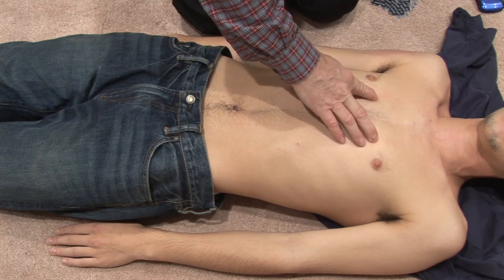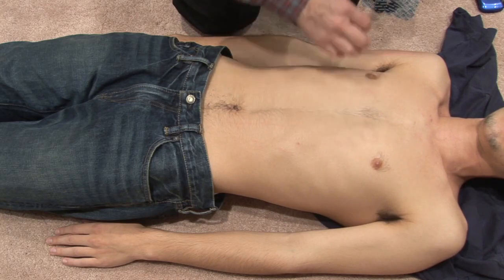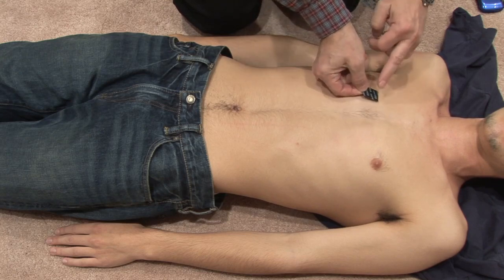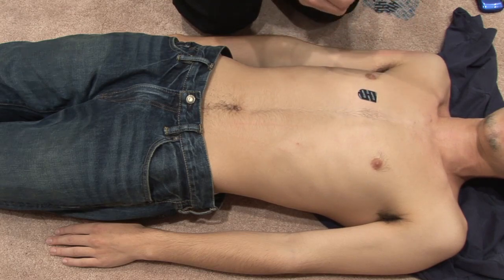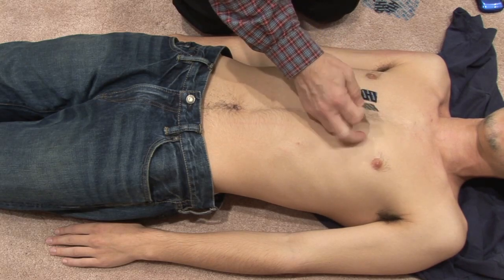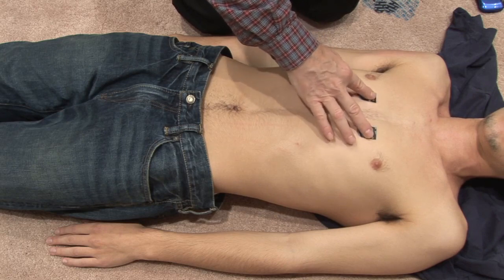Now V1 should go on the right side of the sternum, where the sternum meets the rib, right in that fourth intercostal space, right about here. And V2 needs to go on the left sternal border at that fourth intercostal space. Okay? So that's very important.